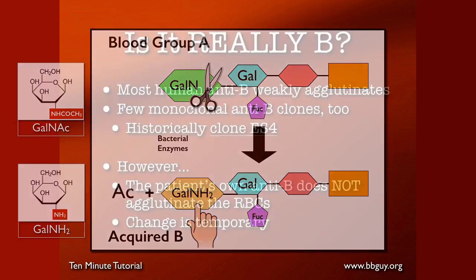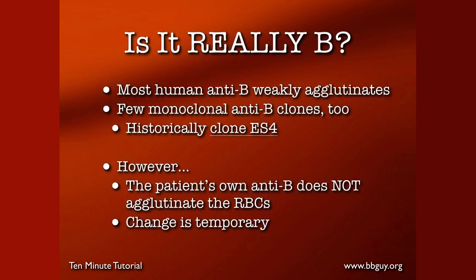Important questions we have to ask about acquired B: is it really B? Well, no, it's not, but it looks like it, because most forms of human anti-B will very weakly agglutinate these acquired B cells. That's especially true when the serum is very fresh; the older the serum gets, the less agglutination you have. A few monoclonal anti-Bs will do that as well. Historically, there was one particular clone that was widely used called ES4. The ES4 clone at body pH would agglutinate acquired B cells wonderfully, so much so that it caused some problems we'll talk about later. However, we know it really is not an actual B because the patient's own anti-B — remember this is a blood group A person with a strong anti-B — will not agglutinate those acquired B cells.